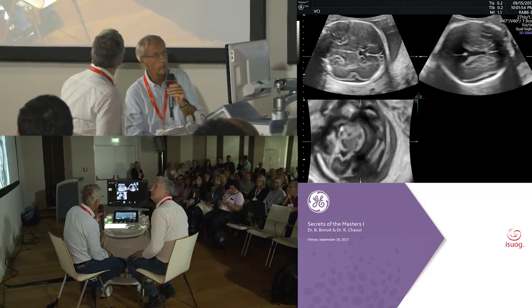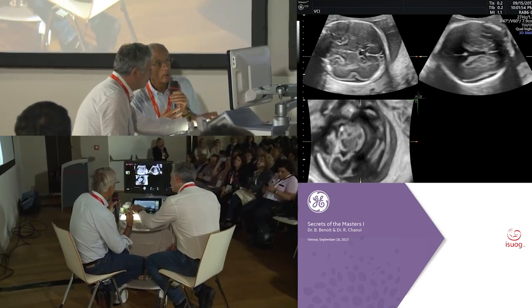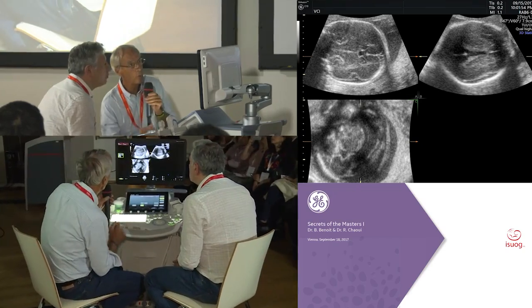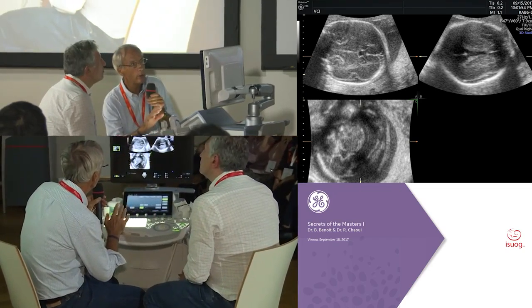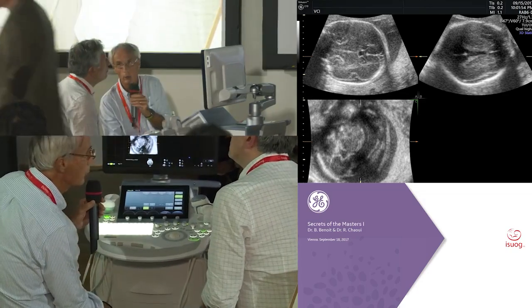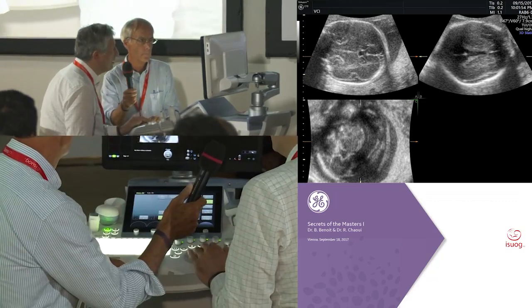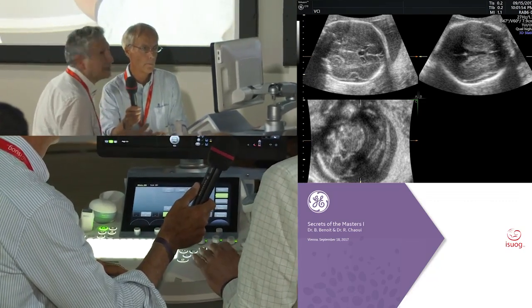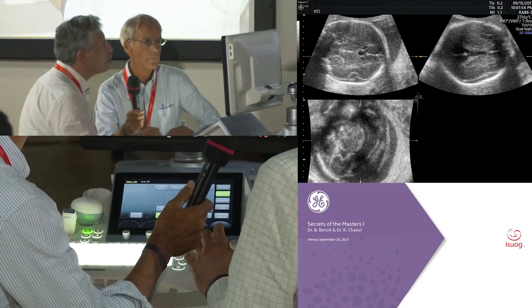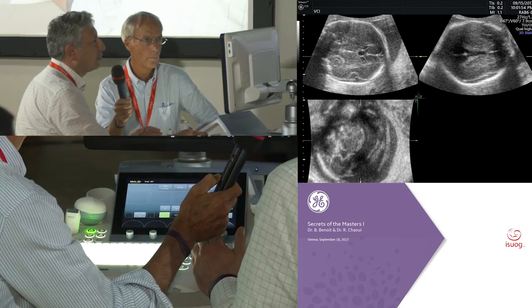So let's start with this brain and just show us how you can, this is only multiplanar, and how to improve the quality of the picture and to obtain from this brain the visualization of the corpus callosum. Yeah, well, in general, when we work on 3D, we assume always it is the surface rendering, but we'll start with the usual application, easily demonstrated on the corpus callosum.